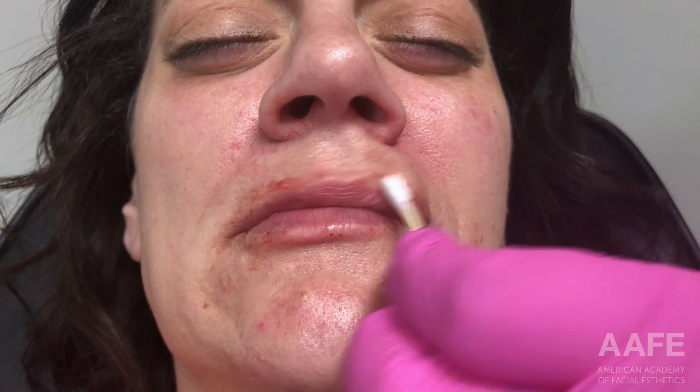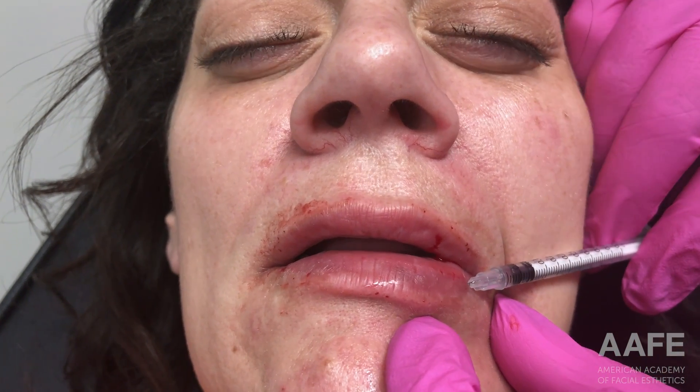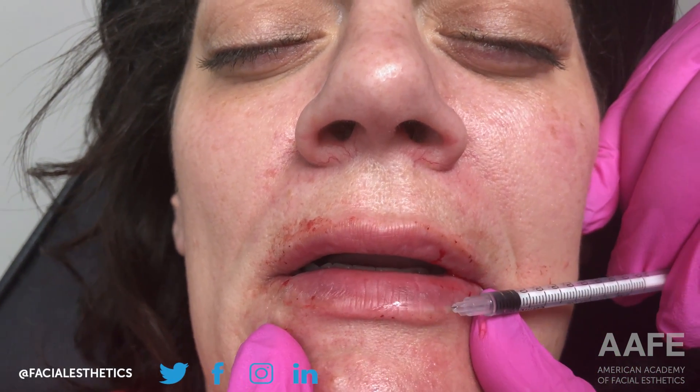She wanted more of a rounded cupid's bow as opposed to a peaked one, so you can see that when I went in to the peak of the cupid's bow I kind of turned my hand in a clockwise fashion to try to round it out as much as possible — hence why you saw me doing that little move with my hand. Most patients like a peaked cupid's bow, hence why the right-angle technique is so phenomenal for that, because it really lifts up and peaks the cupid's bow. But this particular patient wanted it more rounded.